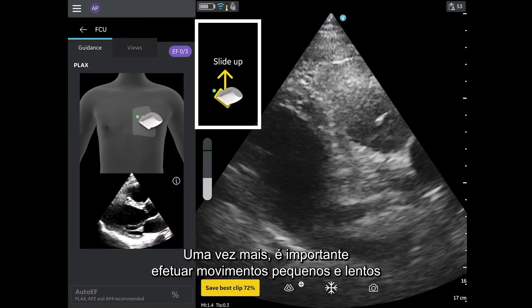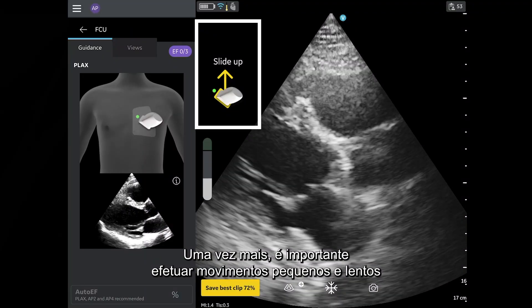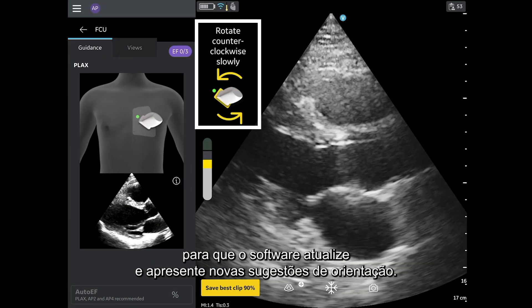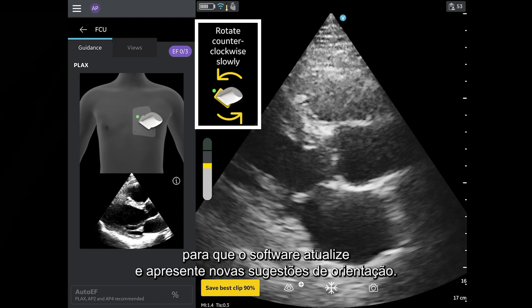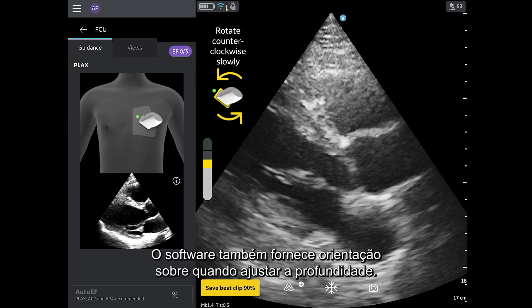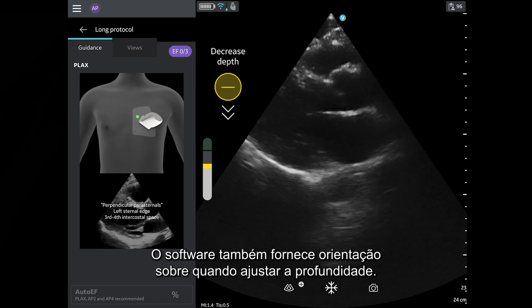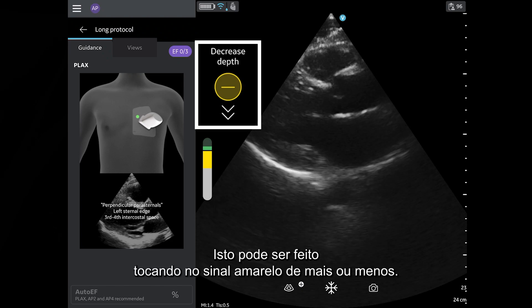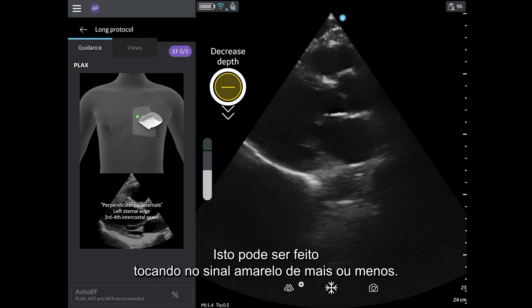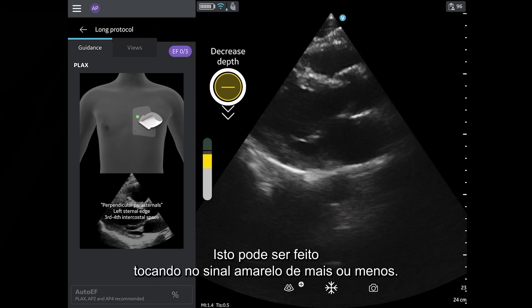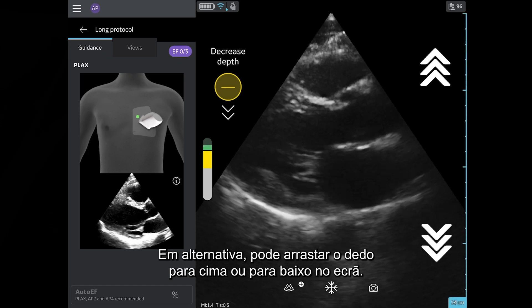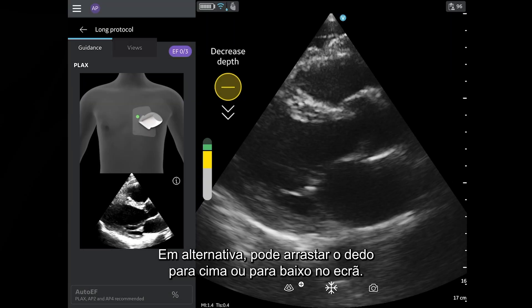Again, it is important to make small, slow movements so that the software can update and give you new guidance cues as needed. The software also provides guidance on when to adjust the depth. This can be done by tapping the yellow plus or minus sign. Alternatively, you can drag your finger up or down the screen.